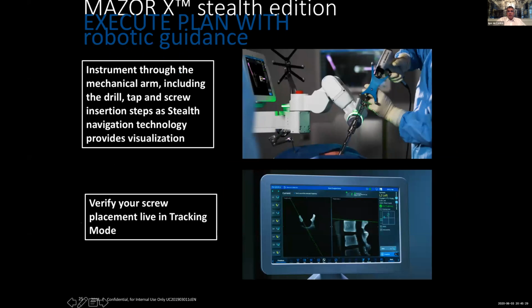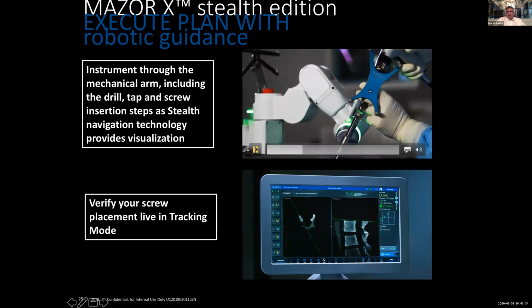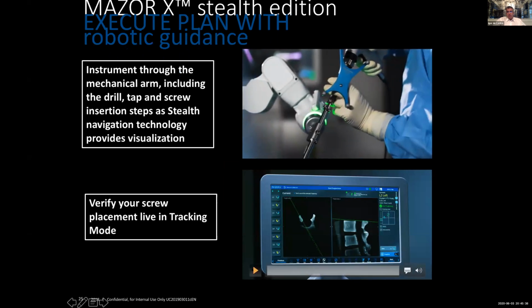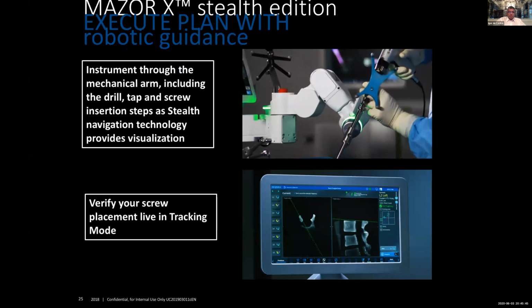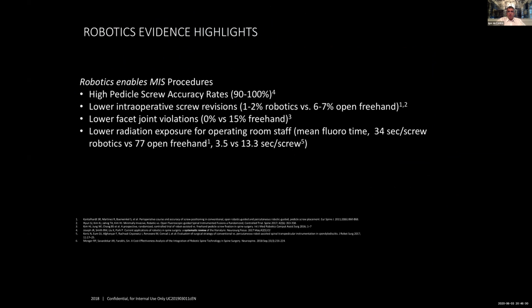And that's what it looks like in the OR. And if you do the case open, I think this video shows you how you can see and follow, with navigation and the robot, how they introduce the screw. It was a very basic talk just to introduce you to the technology. So now, I left all this for Rodrigo and my friends there to look up. I know you guys love research, I love you guys. I left this long, extensive material for you to research if you want to look at those articles.